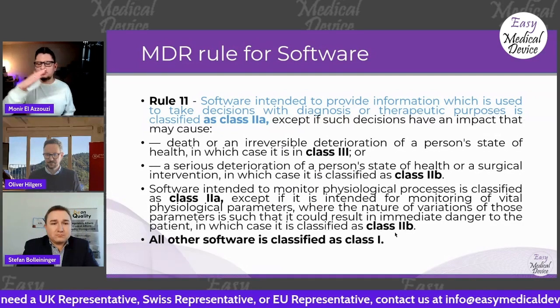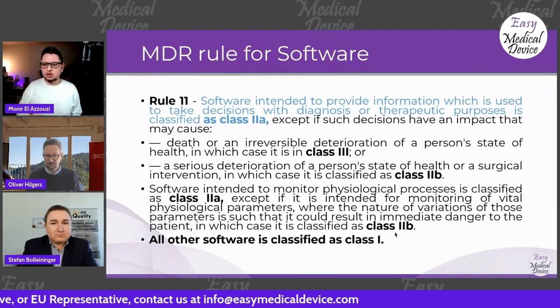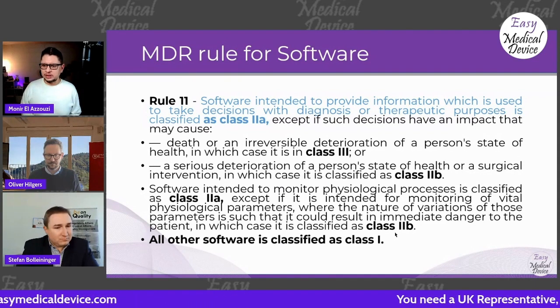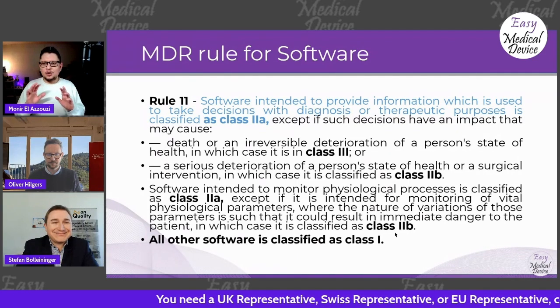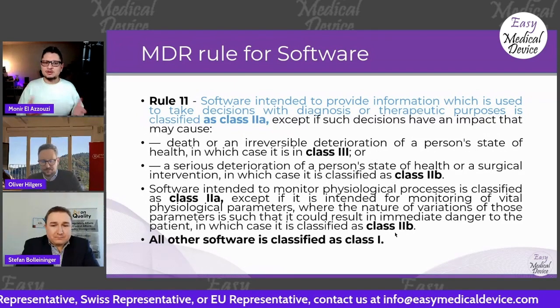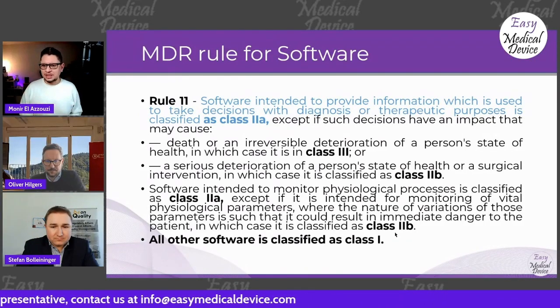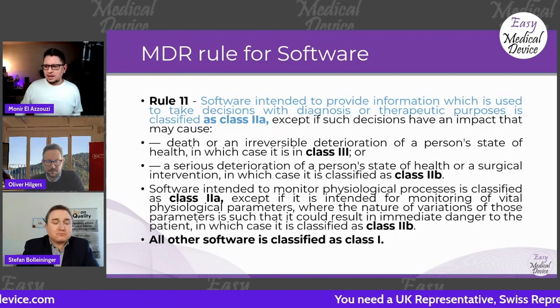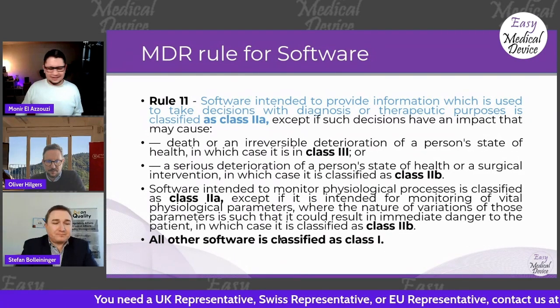So this is not just the point where we have to make a decision. After that, yes, there is some software that, as long as it is there to monitor or verify some physiological process, has to be classified as class 2A or class 2B at the end. So as we said, also a kind of disclaimer: all what we are talking about is dependent on your software, on your intention, on who it is from, etc. So it's a case-by-case study. We really have to work with some professionals, some experts, to make your product fit one of these classifications, which is more difficult with MDR now, but it's still possible. So we still have this possibility here.